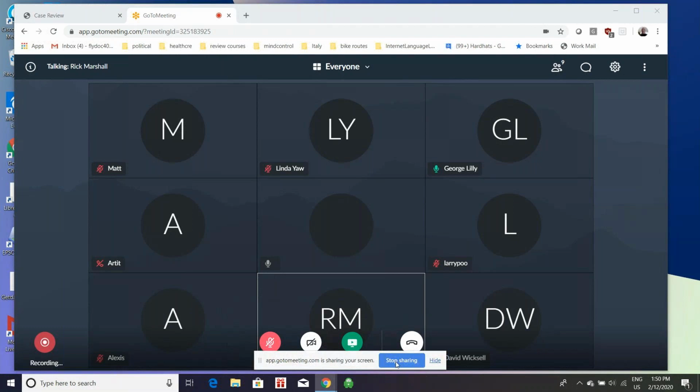Those would be the only two instances of the VAPALS server that he would need in order to support our projected number of VA sites. All they would need is network connectivity to the server, and then we'd need to set up who the users are and which VA site they ought to have access to. If they do manual entry, that entry would go into the collection of patients from that VA site, so we'd have multi-tenancy. When we send out new patches, they wouldn't have to be applied to 10 different servers. They could be applied first to the test server and then to the production server, and serve all 10 of the VA sites that we were planning to do.